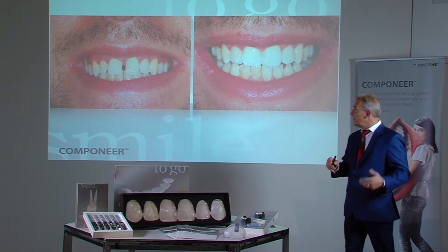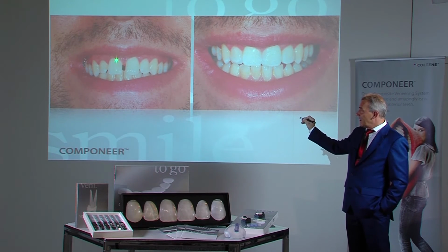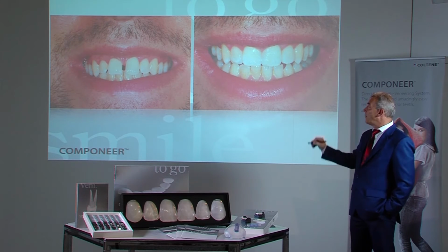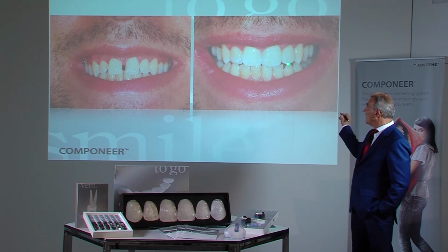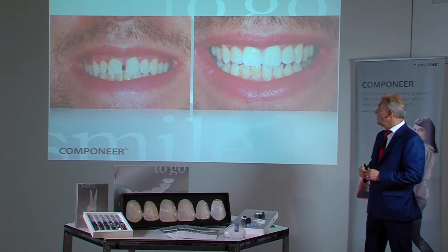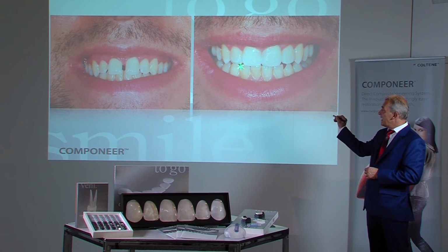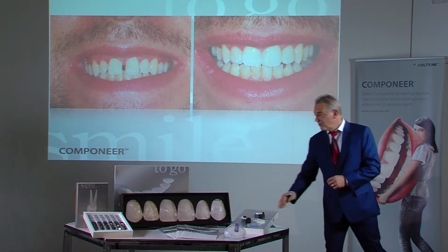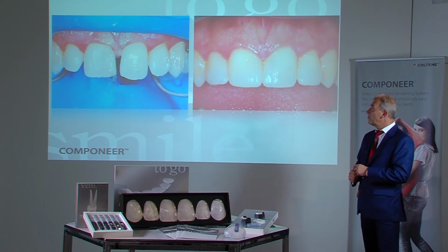Here we can see a similar situation, again with a diastema in the middle. However, we already have a larger gap centrally. The papilla is already somewhat wider and at a deeper level. The diagnosis shows us our objective. Build-up is towards the center. The lateral incisors here, you can see through the translucency, need to become somewhat longer as well as wider. The shape fits the componeer well.